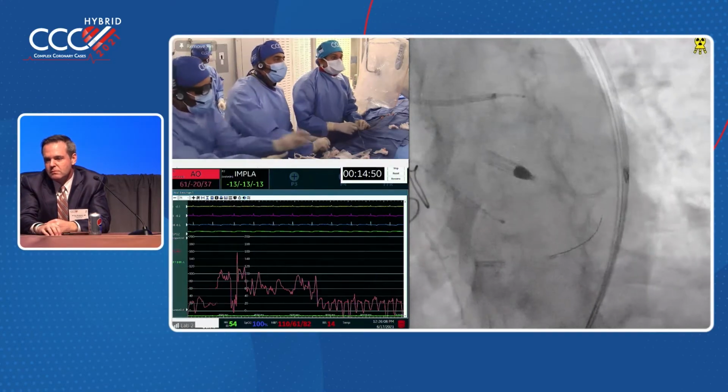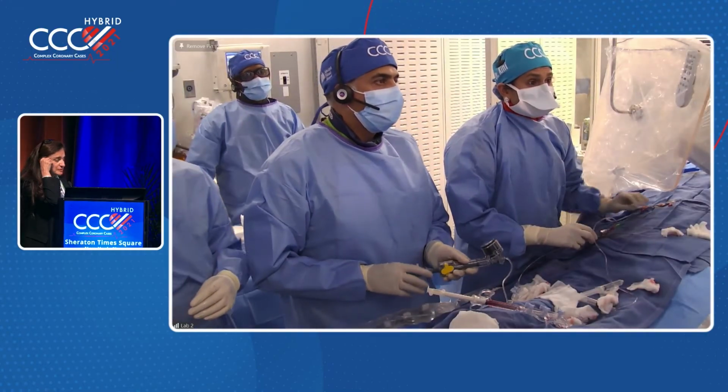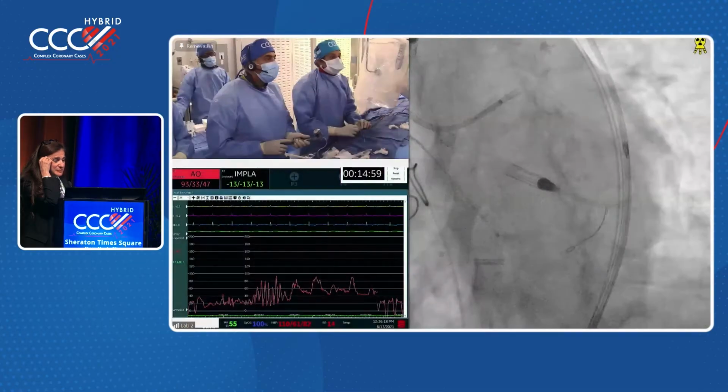Okay. Thank you. Looks like you're putting in another stent. This one is a 12, or yeah, proximally we need another stent. Okay, can we see the left fluoro, please?